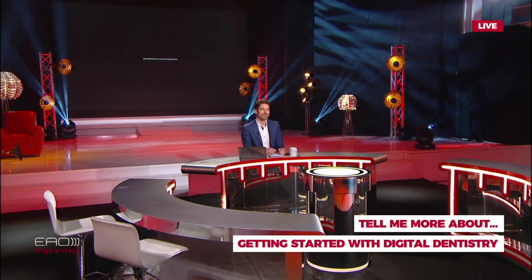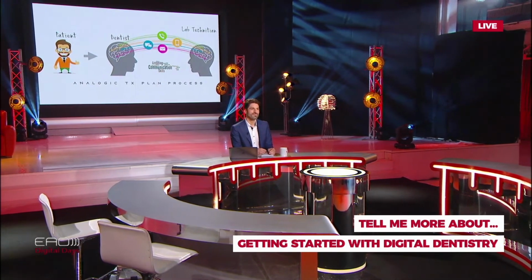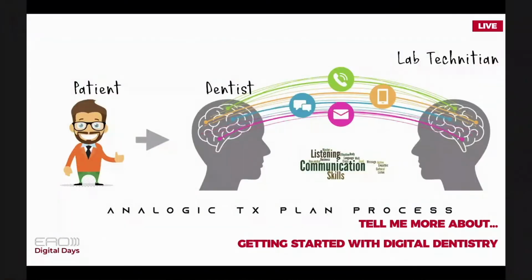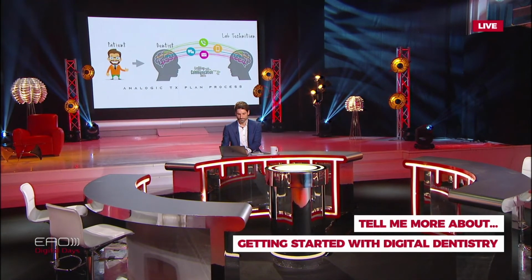But for me, the key of this digital interaction between the patient and the dentist was that in the past, if you have a patient that needs an implant therapy, he goes to the dentist, he tells you a problem that he has, and then your communication with the lab technician is always sending information to the lab technician and then getting back that information from the lab technician. And sometimes we get lost in translation.